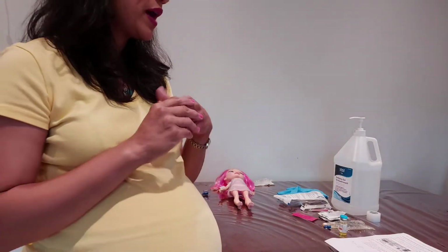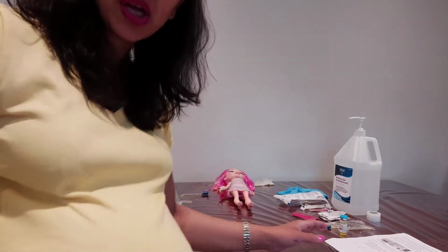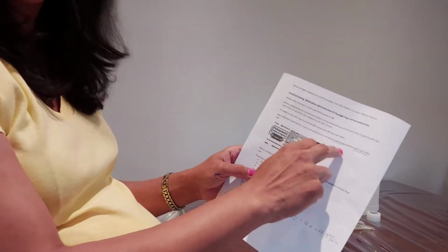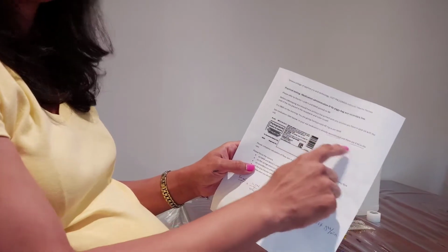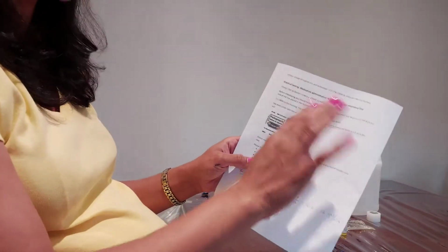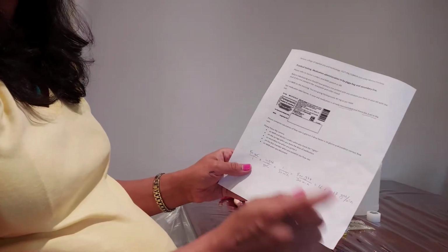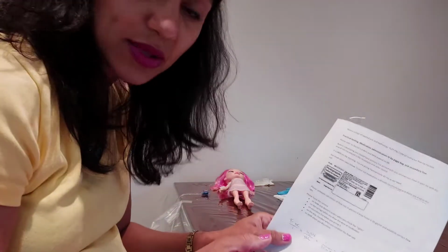Now I have to calculate how much of the medication I need to give to the patient. Here it's mentioned it's already reconstituted, 3 milliliters of medication. We need to inject it into a mini bag, and I need to calculate the flow rate as well.